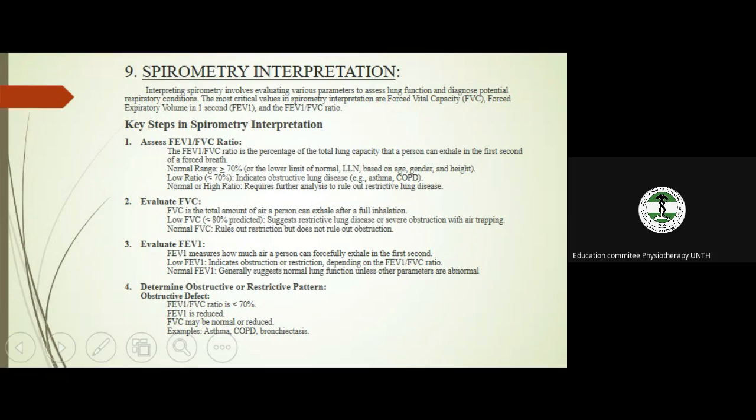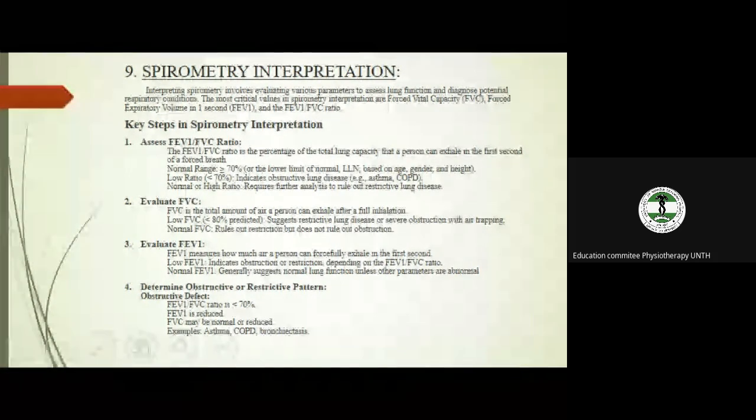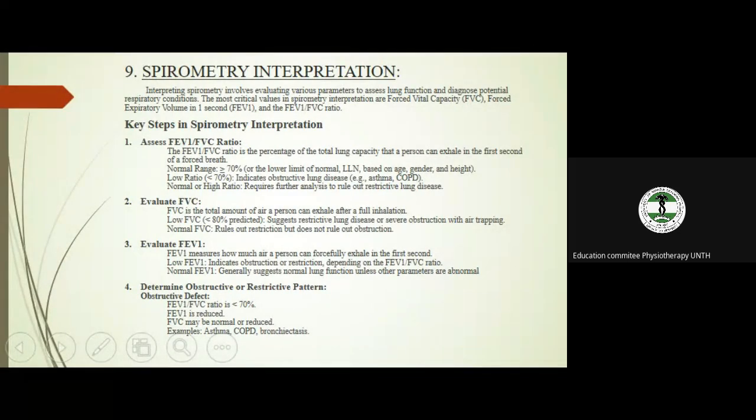But you do a spirometry for a patient, and you can see that the curve is normal and everything. You should look at the parameters so that you can see the percentage. The machine will give you the predicted value because of the age, the height, the race, because all these things you key into the computer, and the machine will be recording all of them.